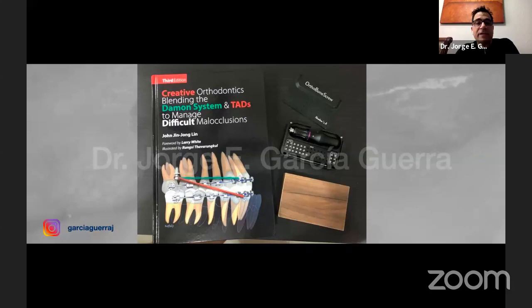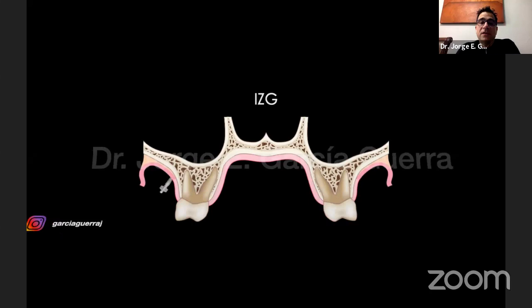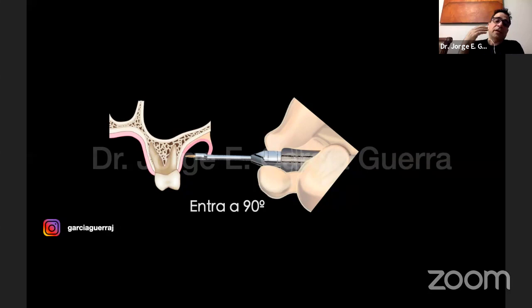Now we're going to see a case where we put in an infrazygomatic crest screw. What we're trying to do here is to put them outside of the roots. Now, I'm going to show you a little bit how this is done. In the beginning, when we put a mini implant in the infrazygomatic crest, first of all, we're going to put the instrument. This is not going to be angled. We're going to be angled 90 degrees from the molar. Now, we start inserting the mini screw exactly at the mucogingival junction.